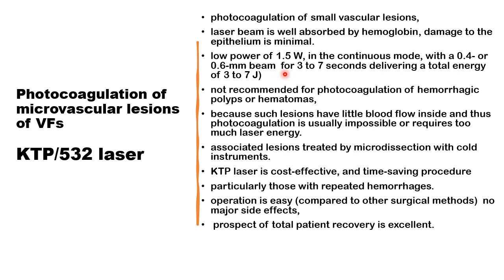It's not recommended to use the KTP for things like a hemorrhagic polyp or a hematoma after a subepithelial vocal fold hemorrhage, because these lesions would require higher doses and can cause more scarring because there is little blood flow inside, and the photocoagulation is either impossible or requires too much laser energy.